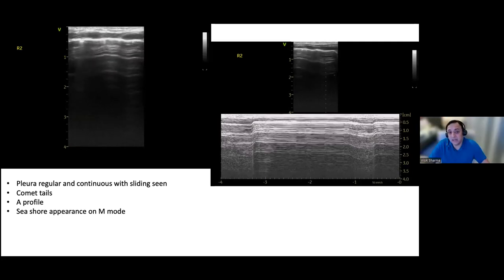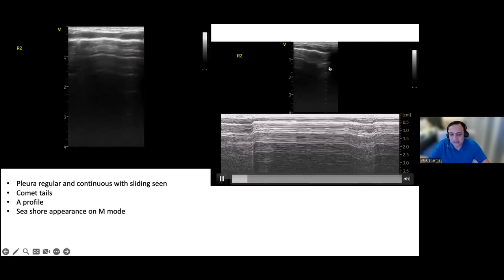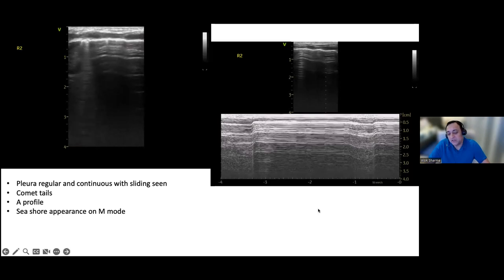I would agree. I think you're just getting a little bit of artifact, because if you look at the way the skin and the pleura move, there's a little bit of loss of contact there. Can you see how with your probe, there's a little bit of loss of contact? And I think it's that region of loss of contact that's giving you this profile. It's a really important learning point. It's beautiful to see the scan, to be able to describe it to colleagues.